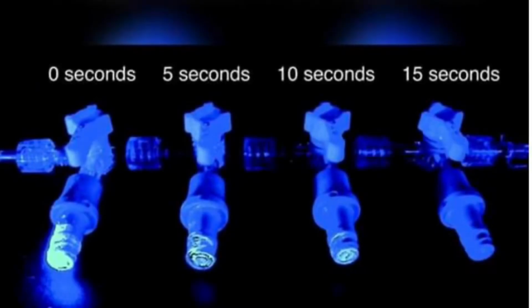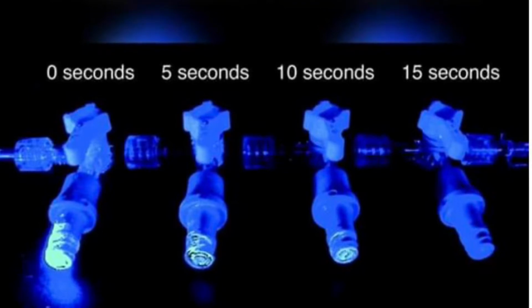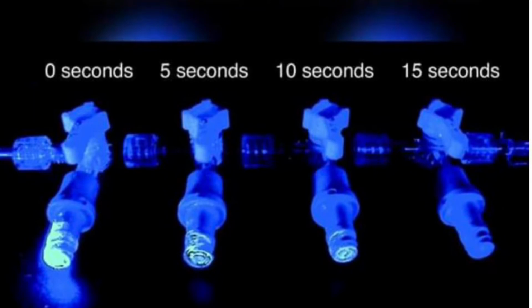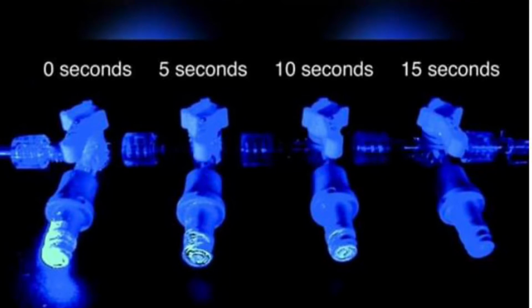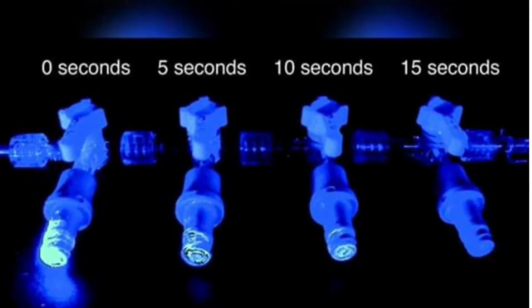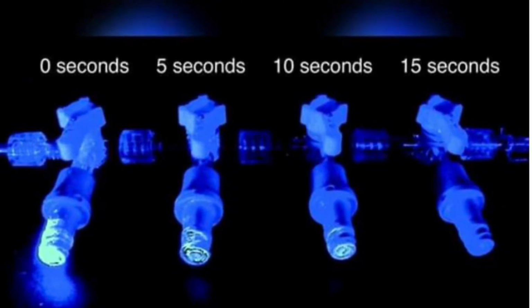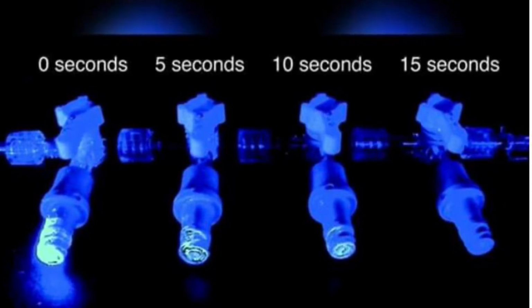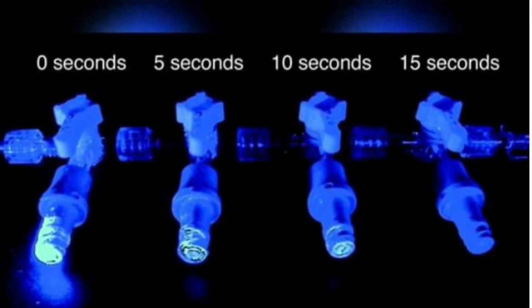It is important to note before starting that when you clean anything during this process, you must vigorously scrub the surface for 15 seconds and then allow it to dry for 15 seconds. This picture shows caps scrubbed from 0 to 15 seconds. As you can see, there are still germs left on the cap unless you scrub for the full 15. The germ killing actually happens during the drying time, so it is imperative to get to dry for the full 15 seconds before connecting. Some hospitals have a protocol to scrub for 30 and let dry for 30. The minimum, though, has to be 15.